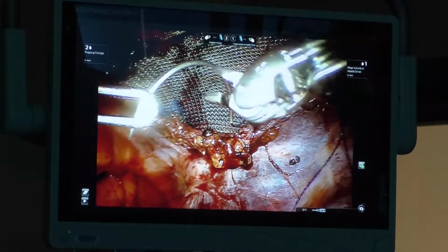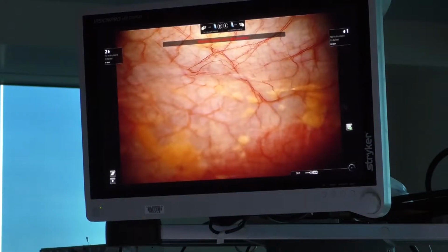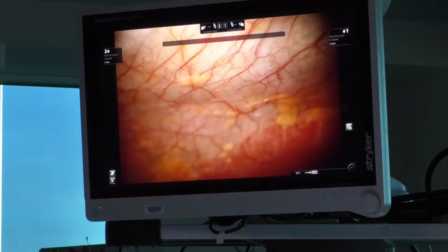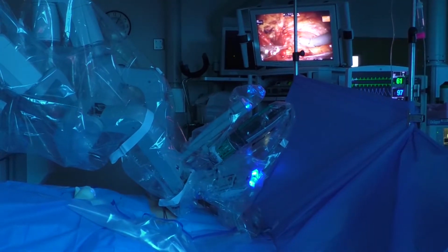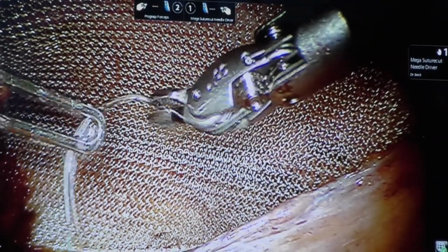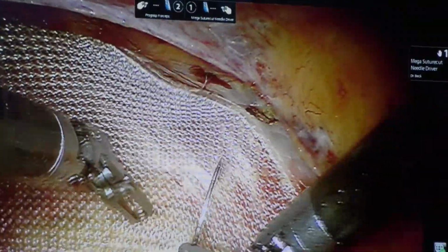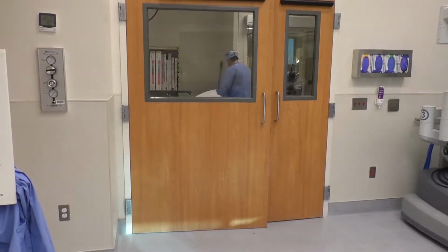This is a case where his previous surgery was done through an open incision, and going back through that open incision is going to be fraught with difficulty. Being able to see all those fine details of the nerves and the blood vessels and the mesh that had been placed allowed me to go back in there from a different approach, see those structures, find the hernia that was almost impossible to find on imaging studies, dissect out that piece of mesh and the nerve that was being irritated, and then repair that and send them home, you know, an hour and a half after surgery.